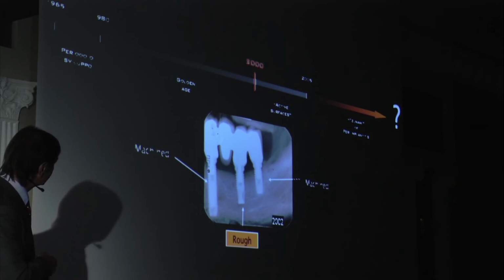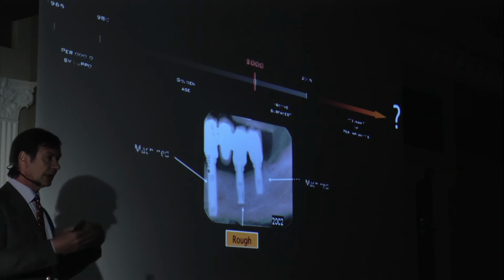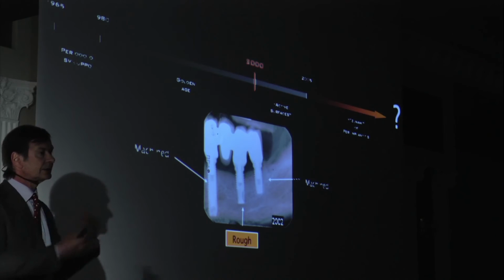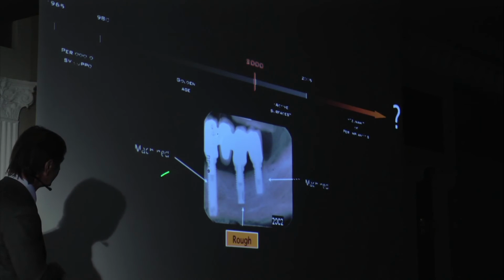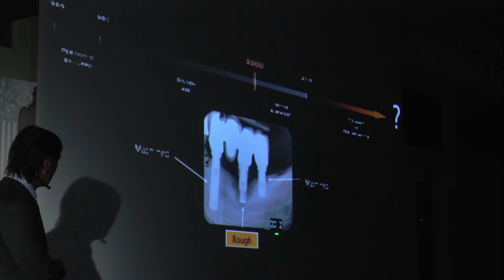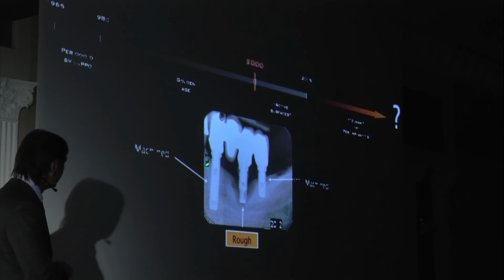Look at this case. Vertical augmentation, machine implants in 2002. Rough implant, because in 2002 I still had some machine implants in my office, but I started to buy the new famous rough surface, active surface implants. So I used 3 different, 2002, 2003, 2012, I think. Very good.